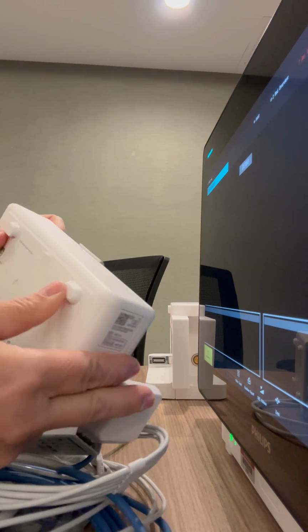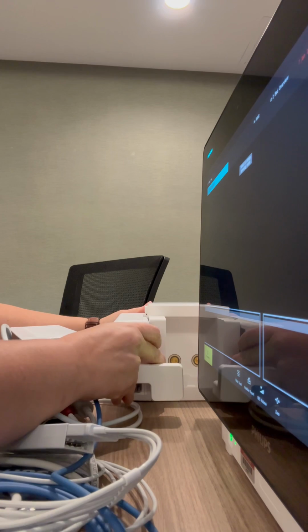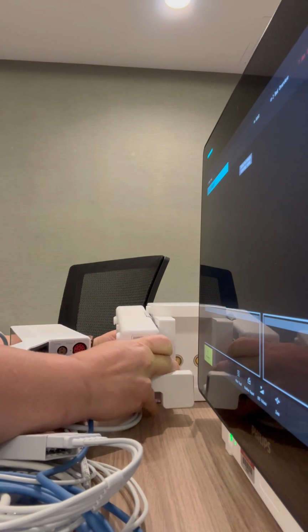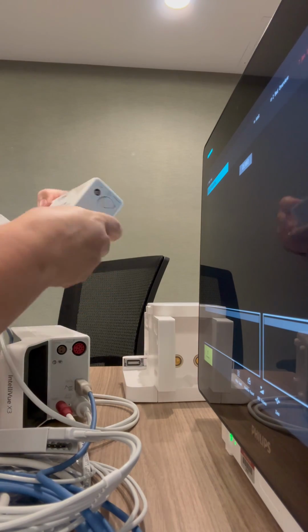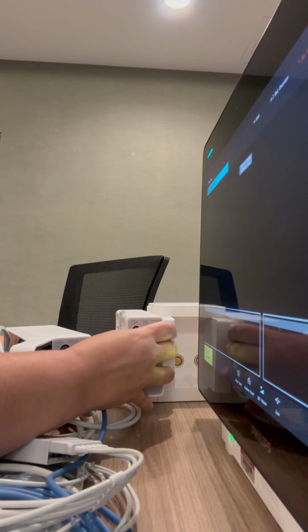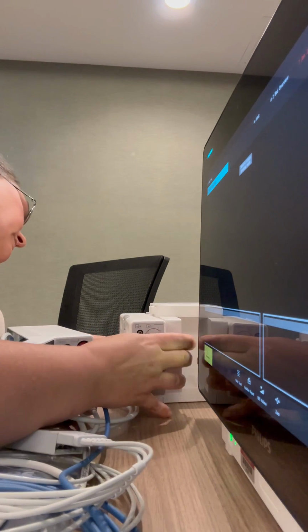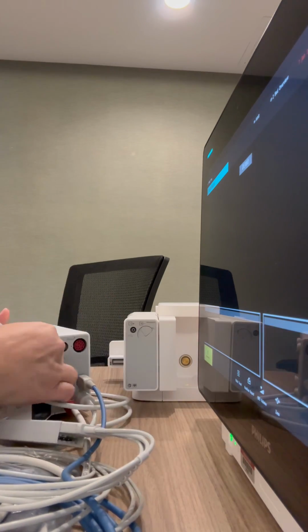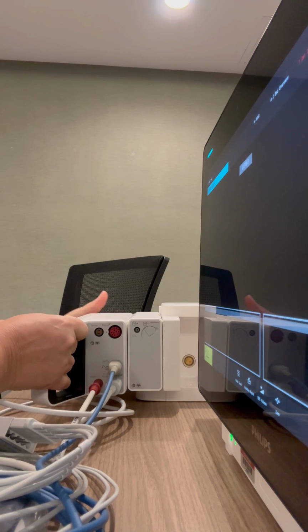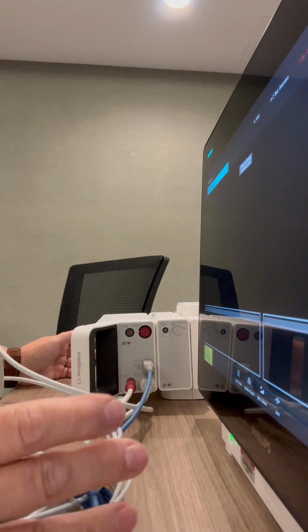And again, it's nipples and sliders. It takes a little bit to ensure that it fits. See, it'll show you. Click the arrow. Make sure it's fitting in the holes. Make sure that's lined up. Again, it'll click. And then with your monitor, with the brain, you're going to fit it in and also click. And that's all you're going to do.